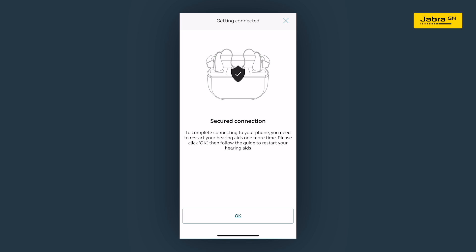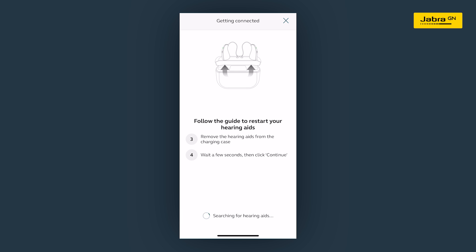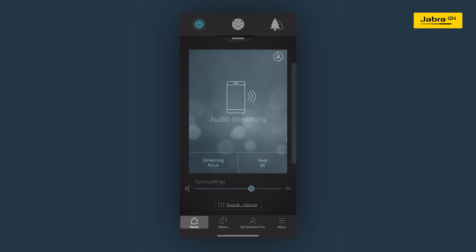You will now be asked to restart the hearing aids once more to establish a secure connection with the app. Follow the on-screen guide. Once completed, the hearing aids are now connected and you can start using the app as part of your hearing experience.